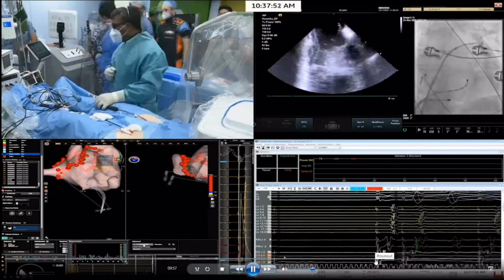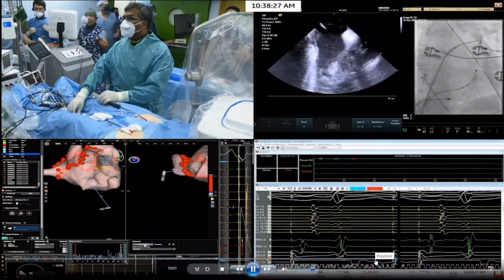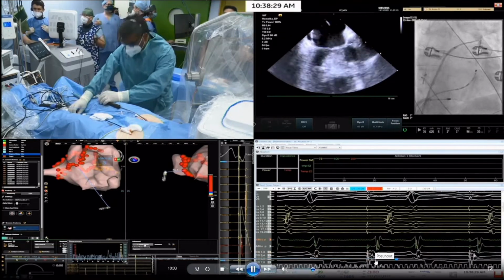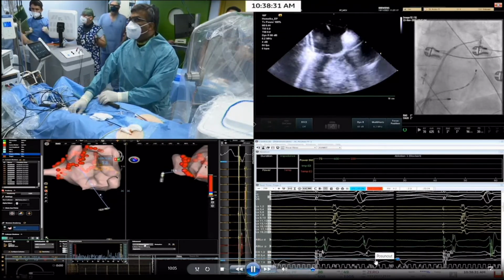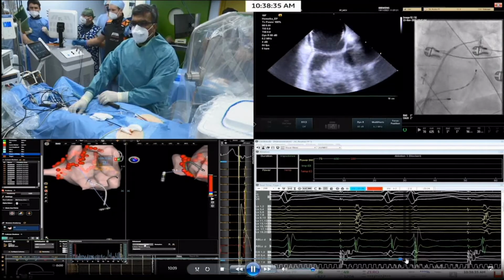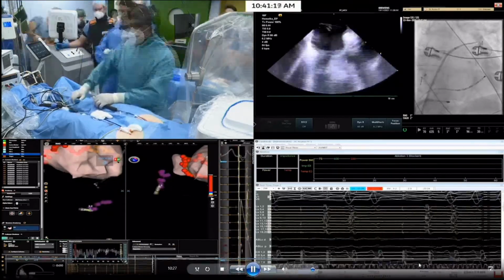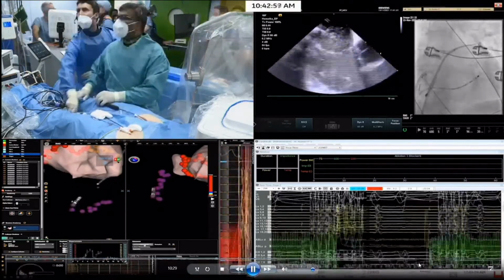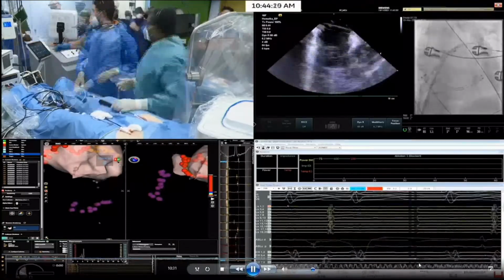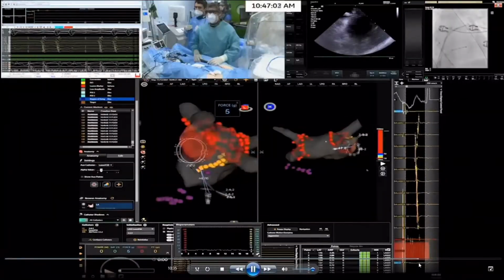So he will put soon the tricuspid isthmus line right now, so he's ready to go. It's nothing too important, so I will switch and speed up. Okay, the line is being created. It's all PFA, right? So it's all PFA and single pulse.